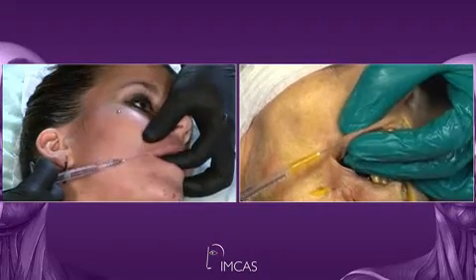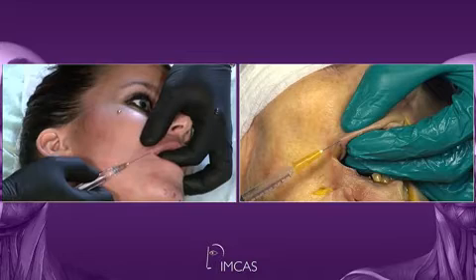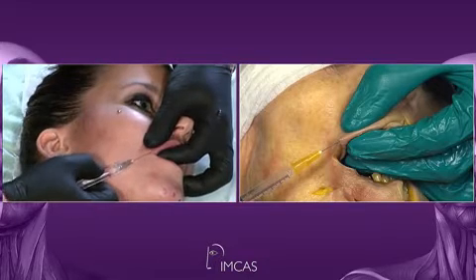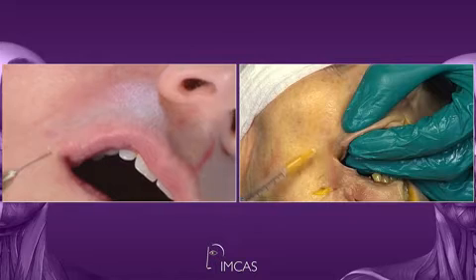So first line, it's about 0.1. We have basically 3 layers of injection, and I like to think of it as creating a horseshoe implant. Stay like that, stay like that.